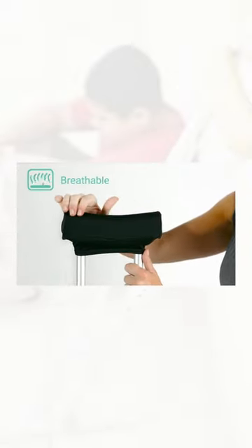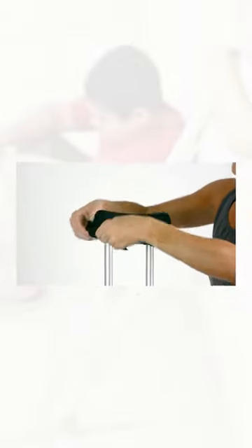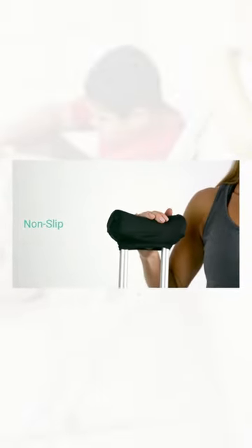They're covered with a breathable, moisture-wicking material that will not cause excessive wear on clothing. The stretchable pads easily attach to standard adult and youth crutches with extra-strength Velcro straps for a secure, non-slip fit.